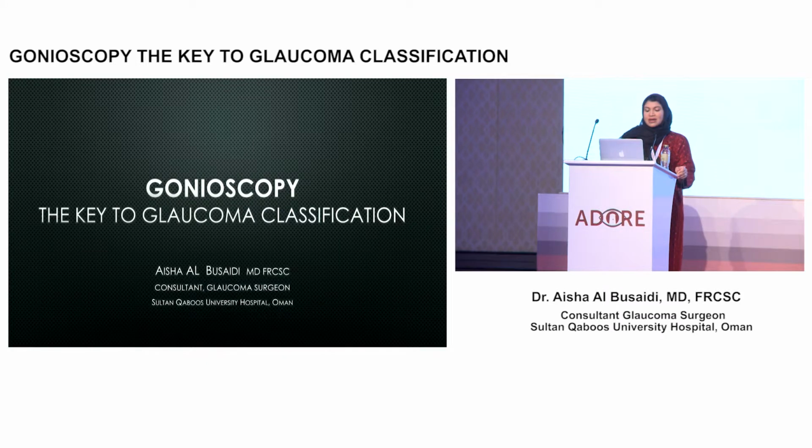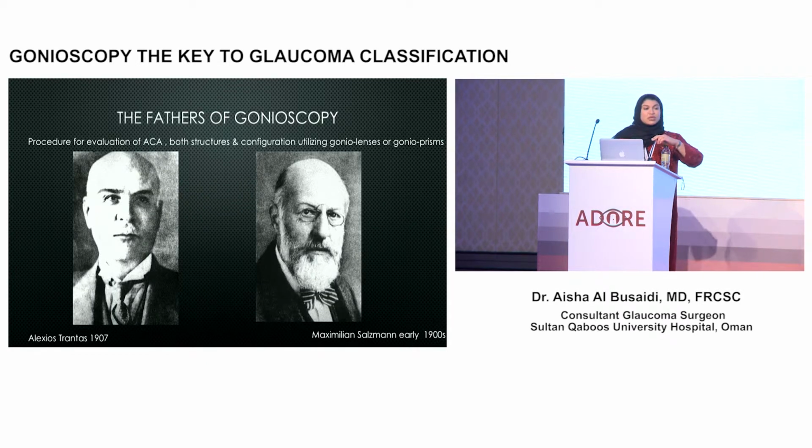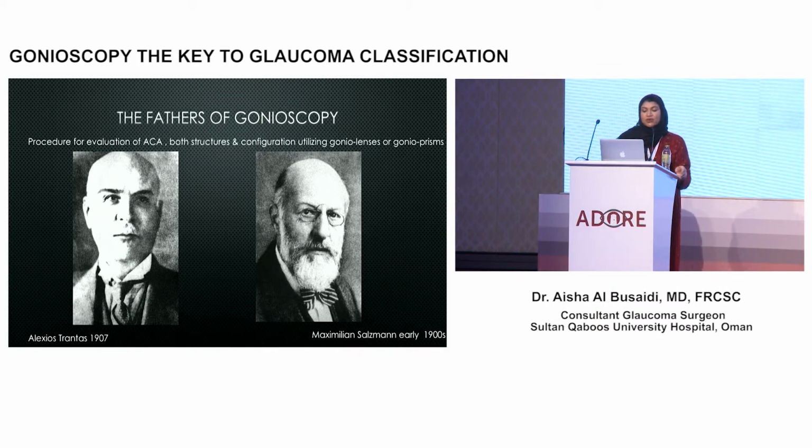Good morning, everyone. I'll be giving two basic talks, one on gonioscopy and the other on laser peripheral iridotomy. The first one, gonioscopy, is a procedure for evaluation of the iridocorneal angle in terms of both structure and configuration, utilizing gonio lenses.